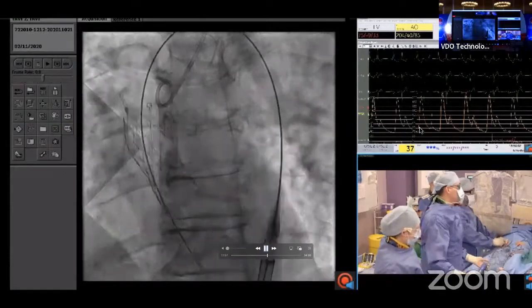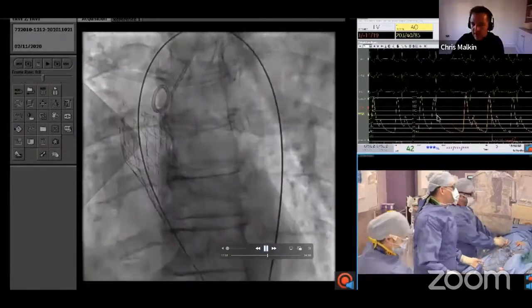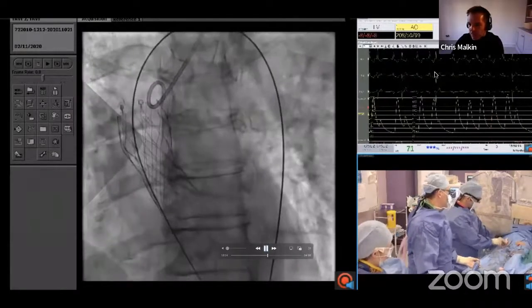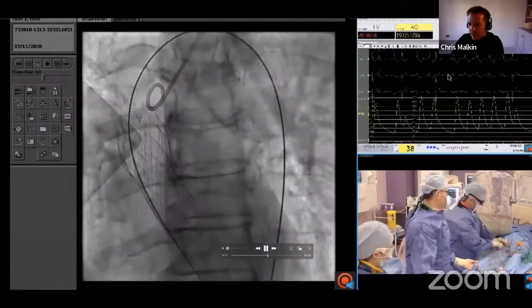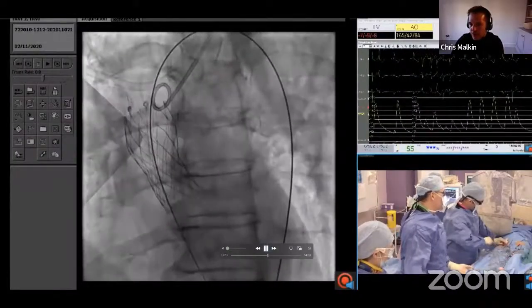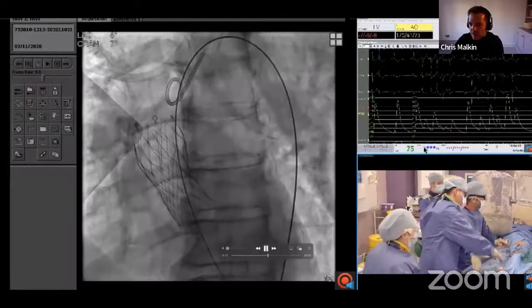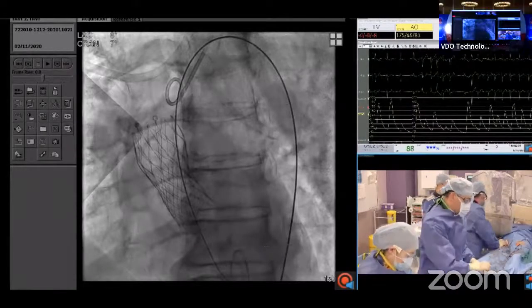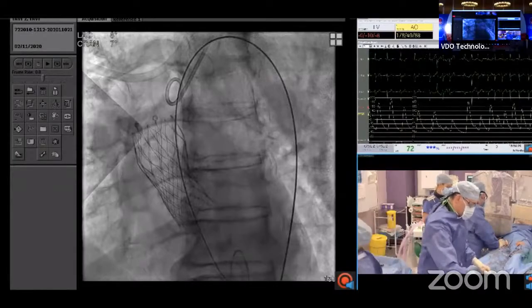You can see that even though it's a very high implant, you probably could not go higher. There's a few ectopics in it. There is actually a bundle branch block. It's still sinus. So, you know, conduction disturbance is still a factor of TAVI implant, but there's no major heart block.